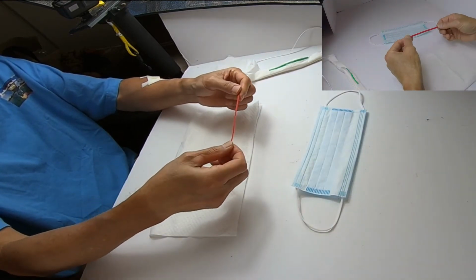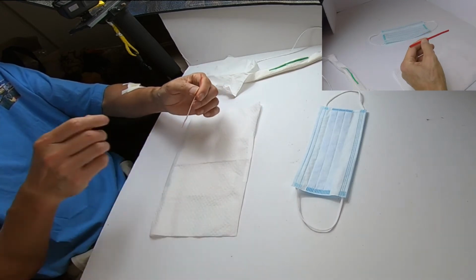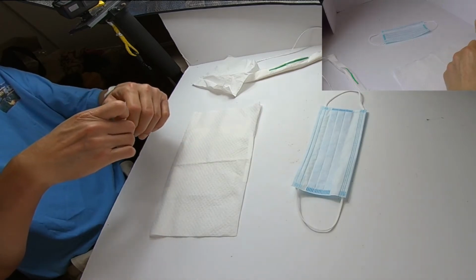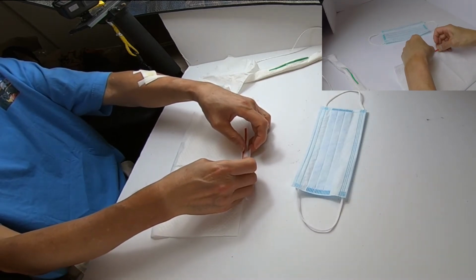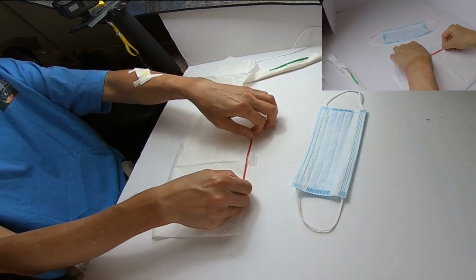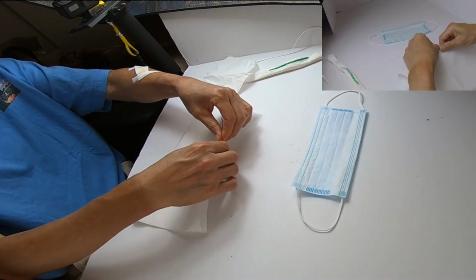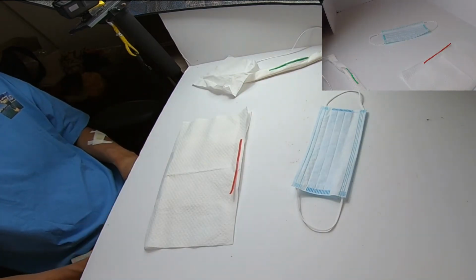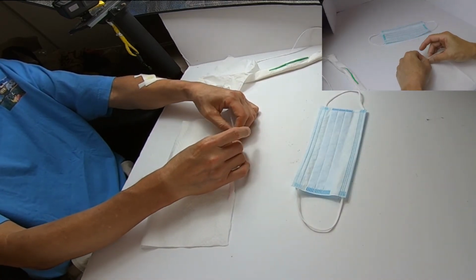Next thing you're going to need is this common twist tie, which you can pick up with every bag that you get. Everybody has probably a bunch of them. Maybe you toss them all away at one time, but they're easy to find. They're on all kinds of bags, like your bread bag, for instance. I would kind of center it using the center crease as a guide. You place it down like so, then fold it down. Then you're going to tape down the edges of the ties. And I would do that.